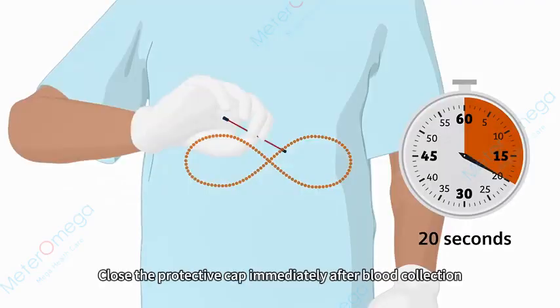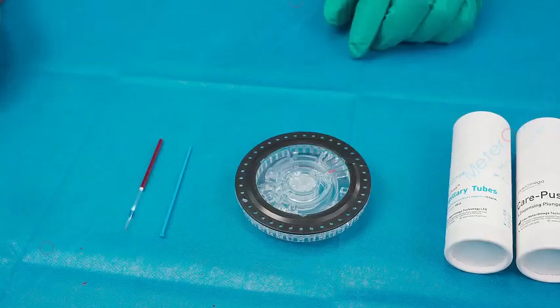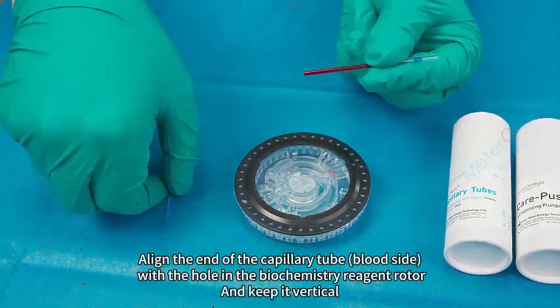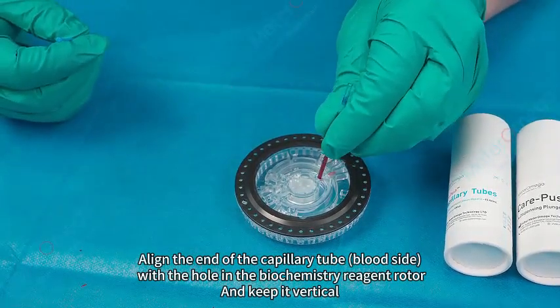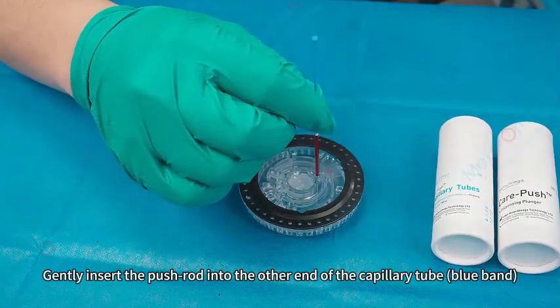Close the protective cap immediately after blood collection to prevent the blood sample from touching the air. Mix the blood sample with an eight-twist motion for 20 seconds. Align the end of the capillary tube — blood side — with the hole in the biochemistry reagent rotor and keep it vertical. Gently insert the push rod into the other end of the capillary tube.